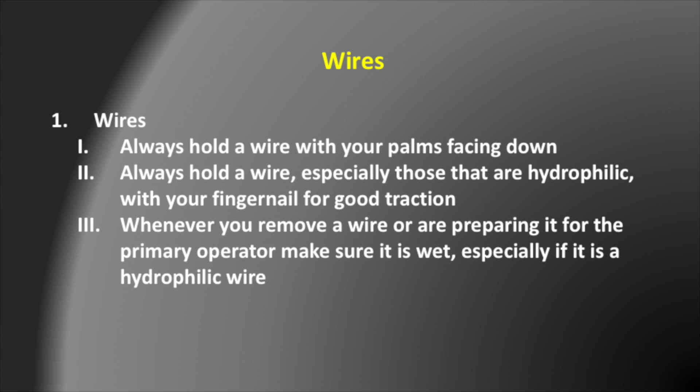We're now going to discuss how to handle wires. Three important concepts: first, always hold a wire with your palms facing down. Second, always hold a wire — especially hydrophilic wires — with your fingernails for good traction and stability. Third, whenever you remove a wire or prepare a wire for the primary operator, make sure the wire is wet, especially if it is a hydrophilic wire. If it is not wet it can become very sticky and difficult to use, and you can get debris and thrombus formation on the wire.